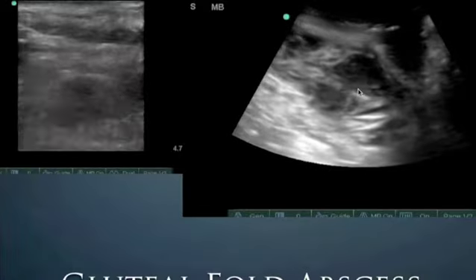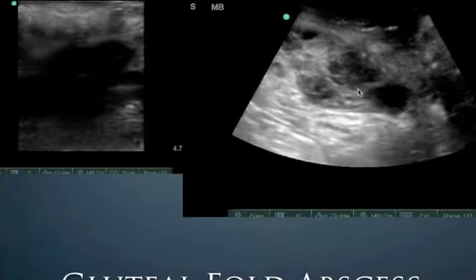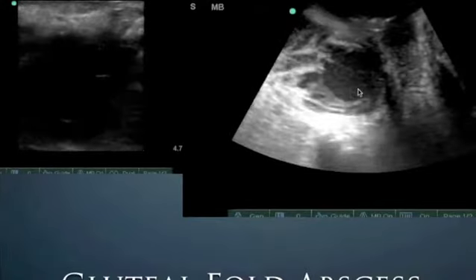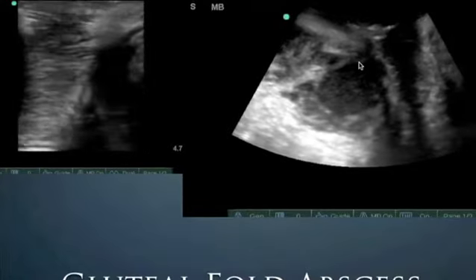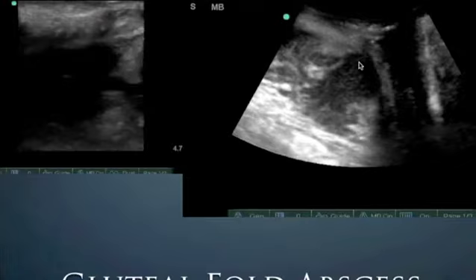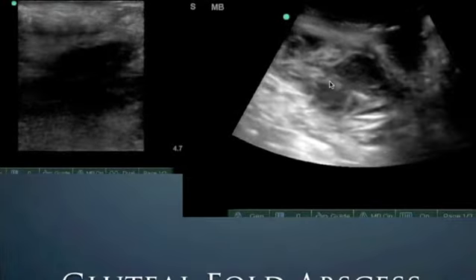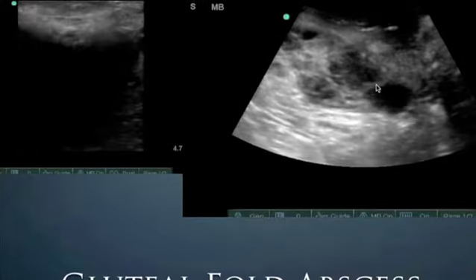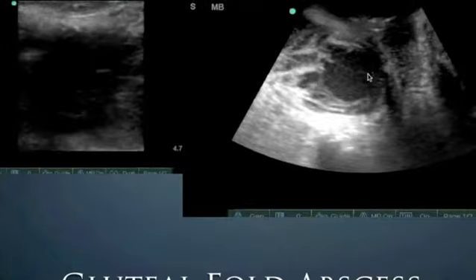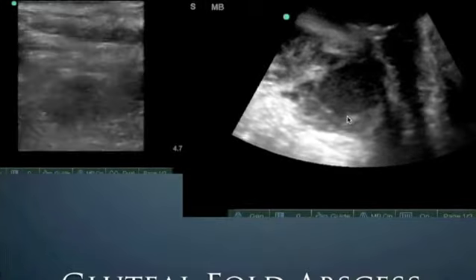The patient simply complained of pain every time he sits down on his tailbone area, and we weren't thinking much of it because there was really no overlying erythema of the skin. However, the guy was very, very tender, so we went ahead and looked first with the linear probe. Couldn't see anything. We moved to the C60 in that gluteal fold. That was the thing to do. We could see this large abscess down here that was later confirmed on CT scan.